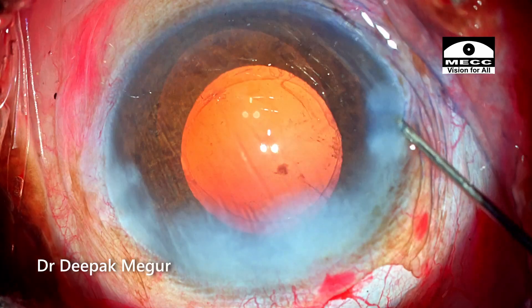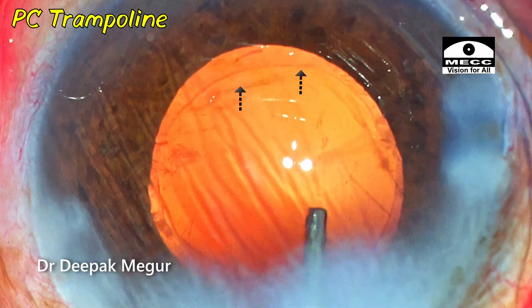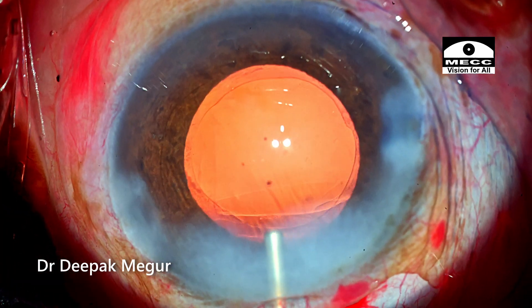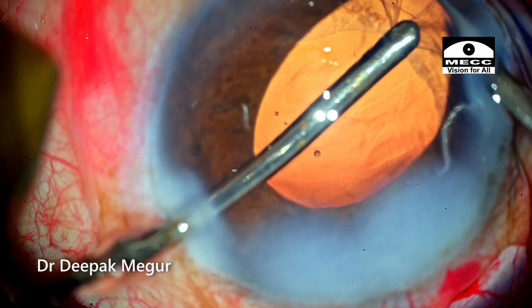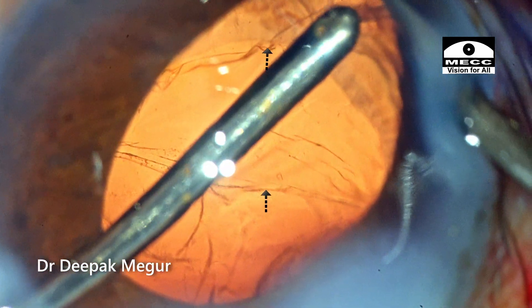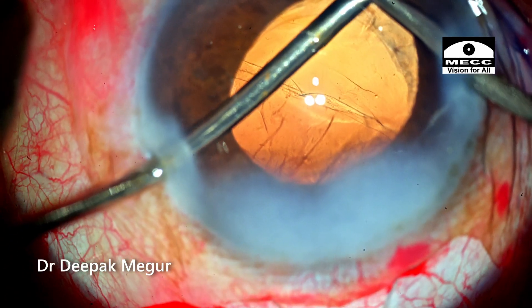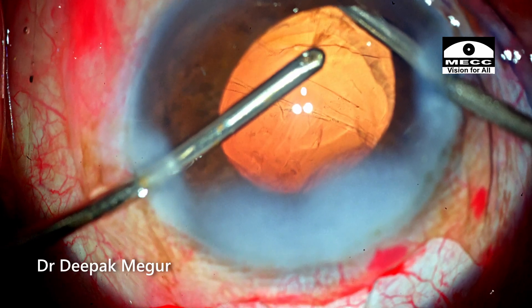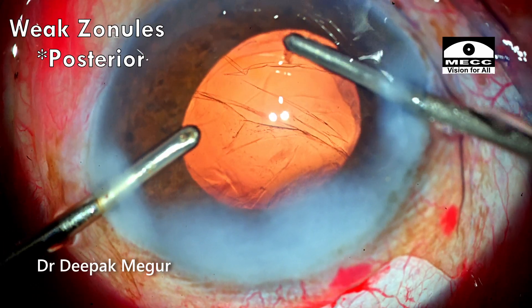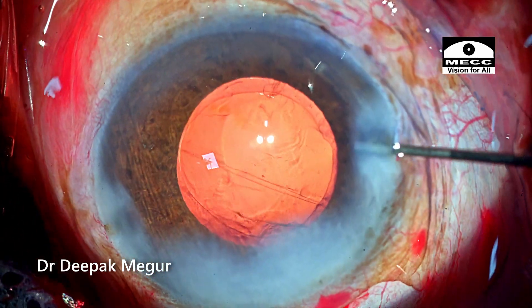I'm not sure what's going wrong. I come out and try to form the chamber with irrigation, and I can see that the posterior capsule is just trampolining and folding all around. I go back and refill the chamber with viscoelastic and try to aspirate the last bit of cortex. But the severity of the capsule folding and trampolining is very much evident now. My initial diagnosis was that the capsule is trampolining because of weak zonules — more evident now because the bag is empty of the bulky nucleus. That was my initial judgment.